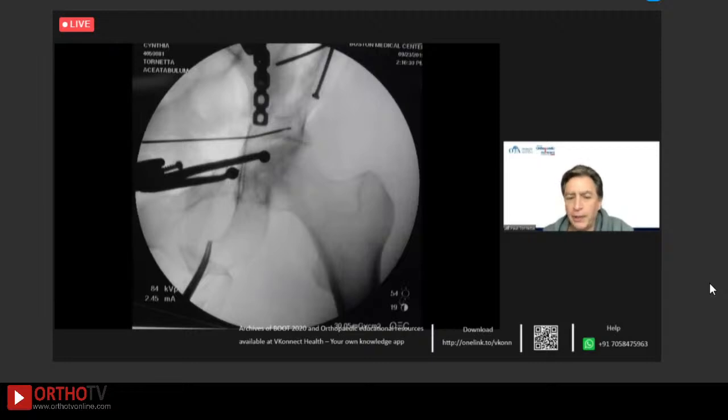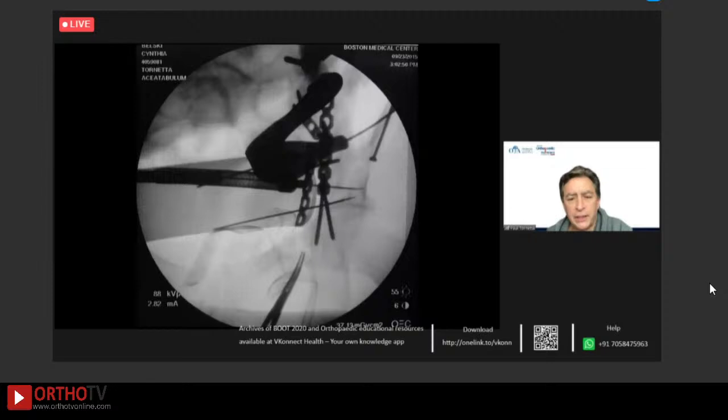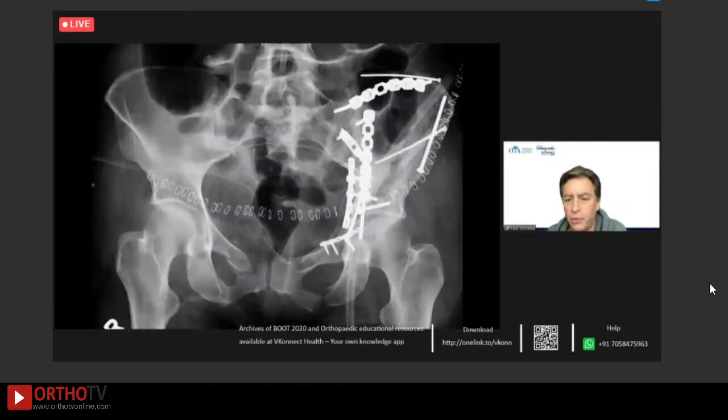Then we started to work a little bit through the AIP portion of the approach. So this is an ilioinguinal, but I extended to the medial window. I usually do not use the medial window in an ilioinguinal, but here we went that way, and it's basically the same as an AIP. Then we finally got some fixation into the back that was stabilizing the whole thing. And just like Hassan said, little plate here, little plate there. Let's push on this. Let's push on that. And this is about 9 years ago now. And this is what we ended up with on the front view.